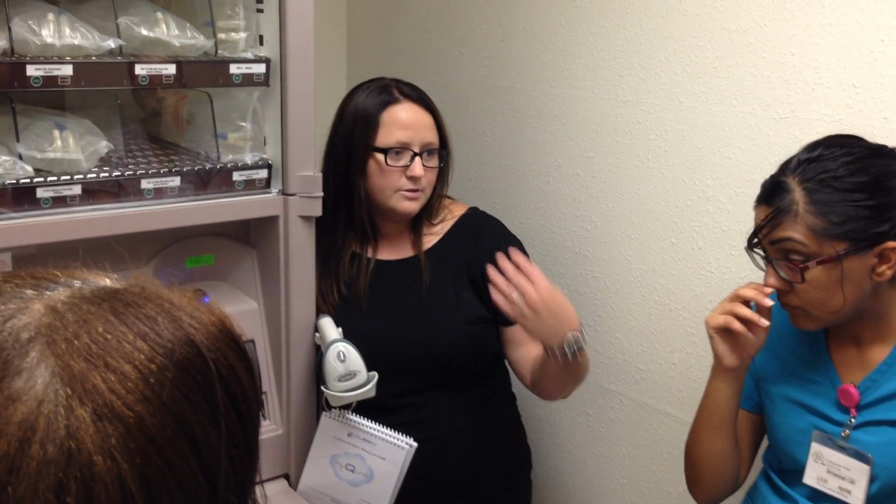It's a great question. We have facilities that do it all the time, and unfortunately, I've actually taken access away from a nurse because she wouldn't stop pulling multiple doses. Once you take it out, you can't return it, first of all. Second of all, what if they don't have that quantity left on their script?